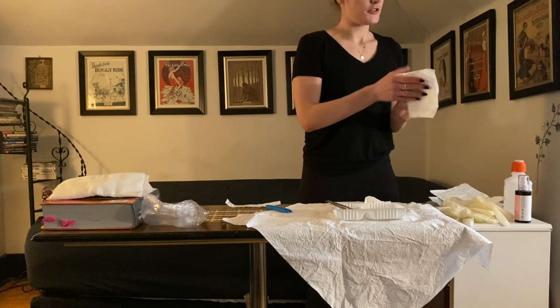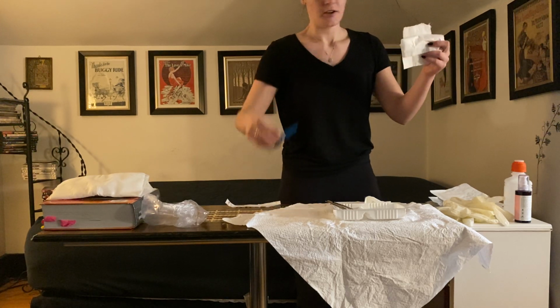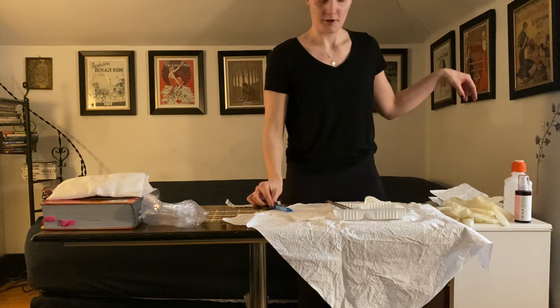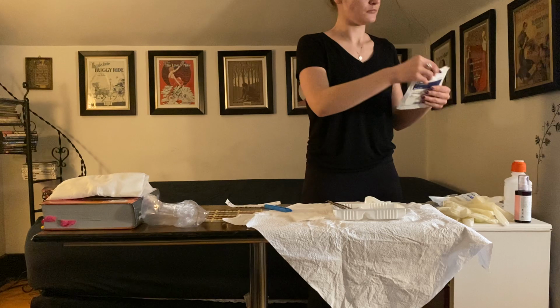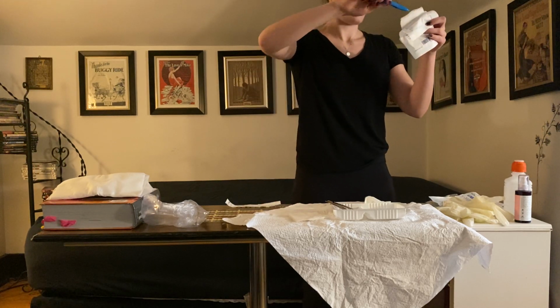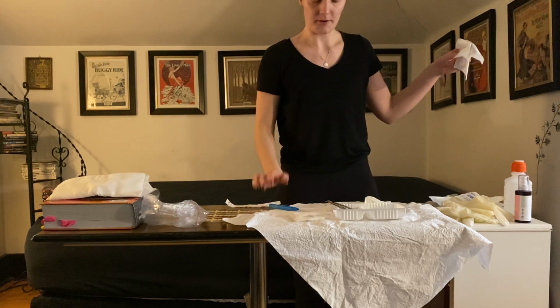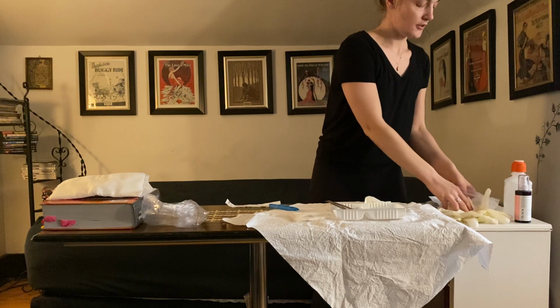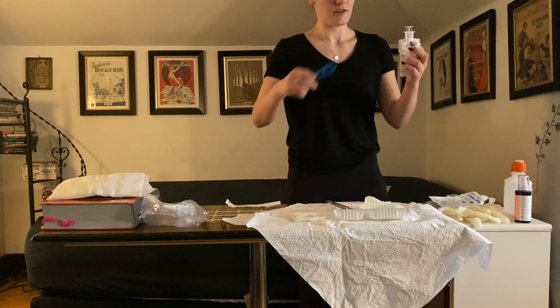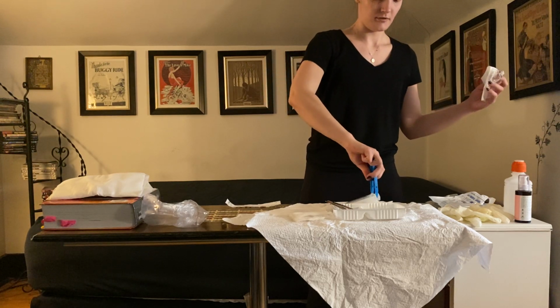Okay, and then I have my 2 4x4. So this is what I'm going to be covering the wound with after I pack it. So I just want to put 2 by the side. And always just remaining mindful of my 1-inch borders. Then I have my 30 cc syringe here for the irrigation, winging that back, gently adding that to my sterile field.